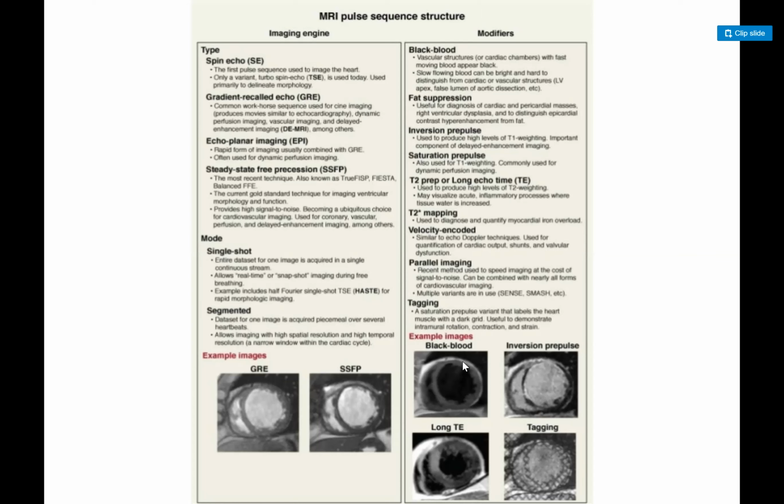In T2 weighted images, you have a long echo time. And what does T2 do? It helps you identify anything with edema, water, and especially the inflammation. If there's myocarditis, or myocardial infarction, you will see elevated bright signal in the myocardium in these images.